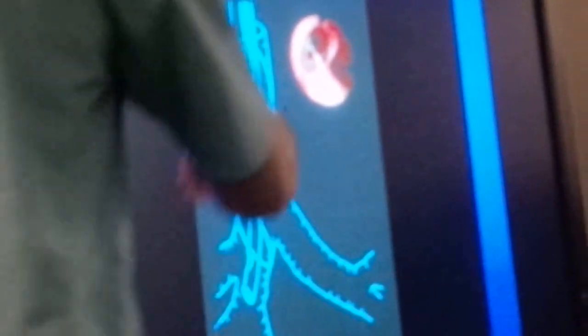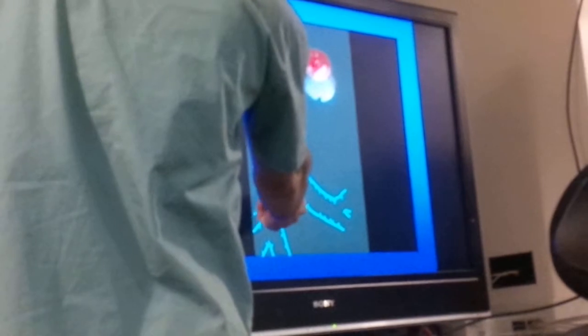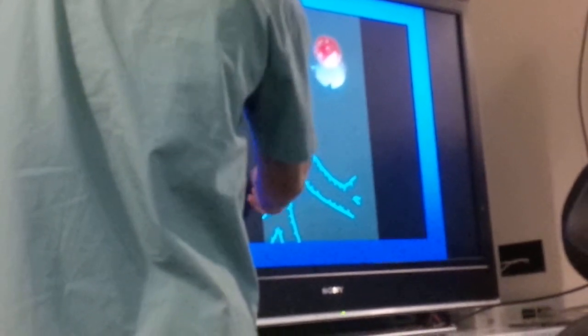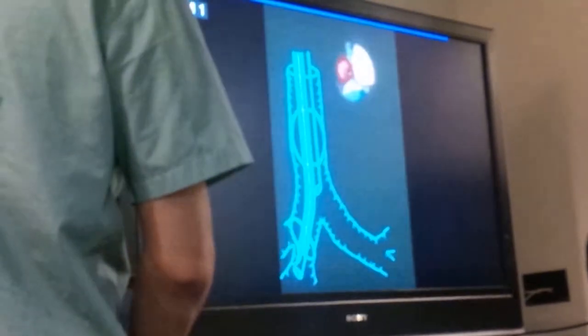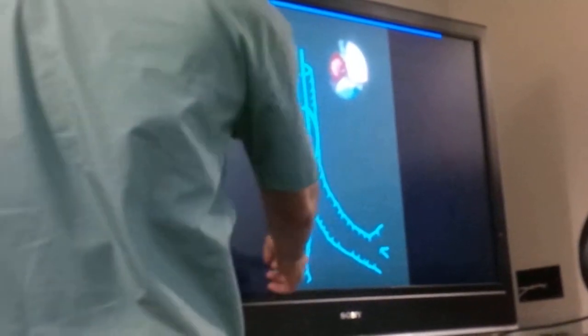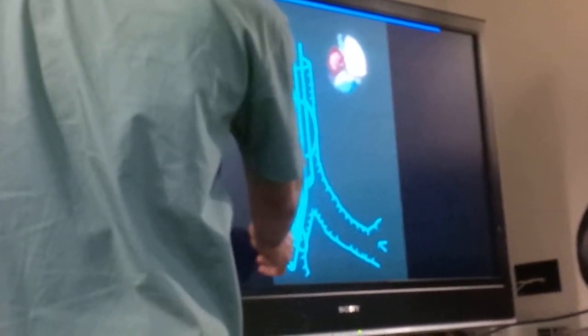Okay. How to confirm it? We go to the bronchoscope. We see the carina. We go to the left side, confirm this is the secondary carina. Then we see the cuff, as usual. Now we have to go with the bronchoscope to the right side and face this slot to see the right upper lobe bronchus. This is too much, and you can see the slot is not aligned, and the cuff is blocking the right upper lobe.